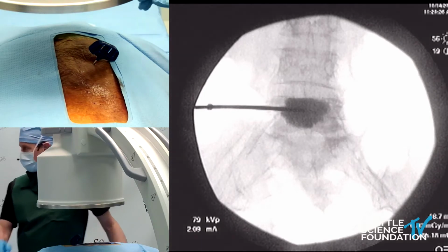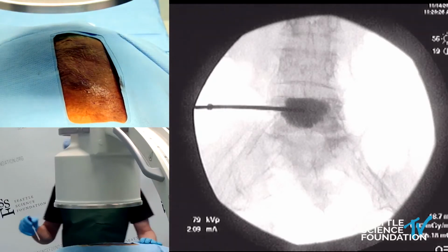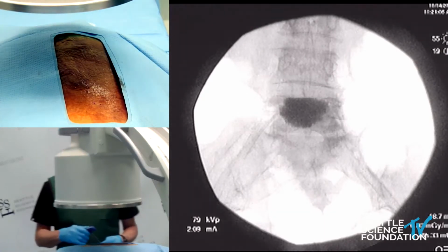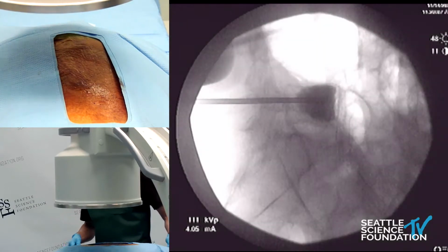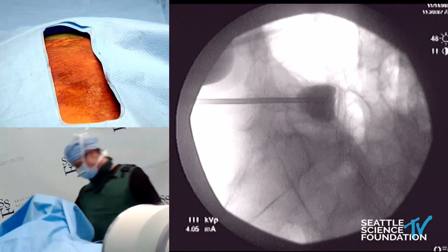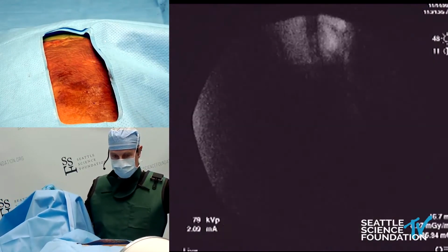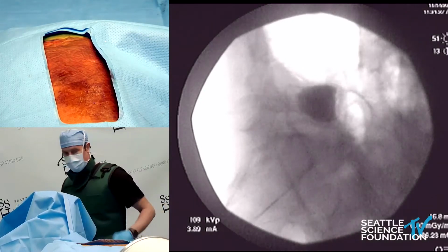Thank you, Phil. All right, next I'll pull this out, and we will do a bilateral spine jack. I want to get one final view of that. So we save that. You're right on track about halfway right now. Great. Let's take a lateral shot. And why don't we do a spine jack at that level above at L4. Save that one. And back around, please.